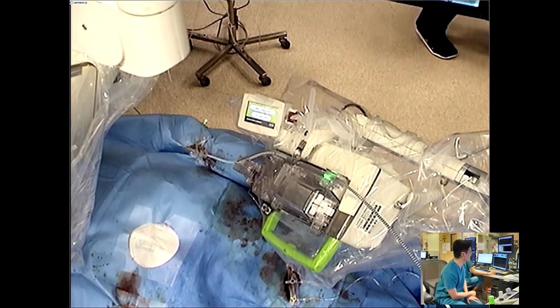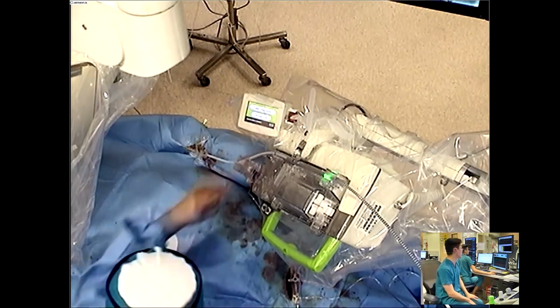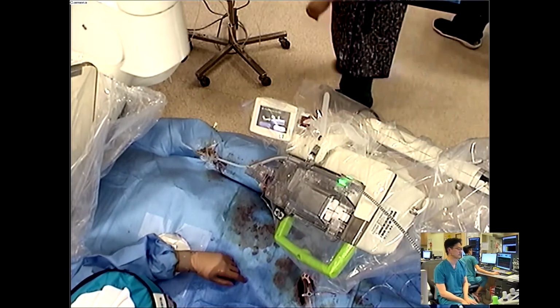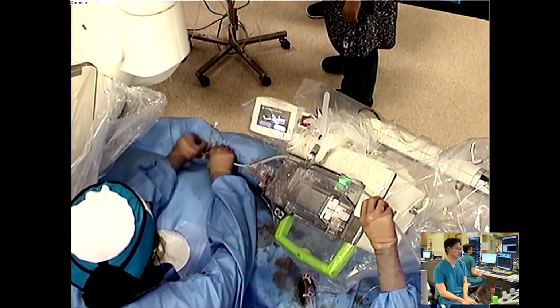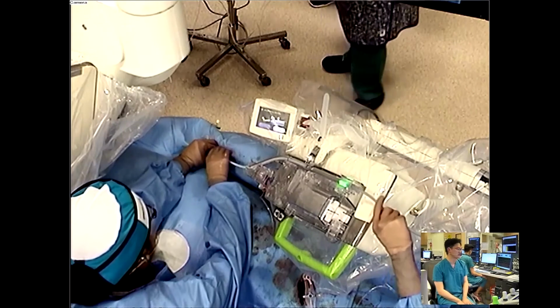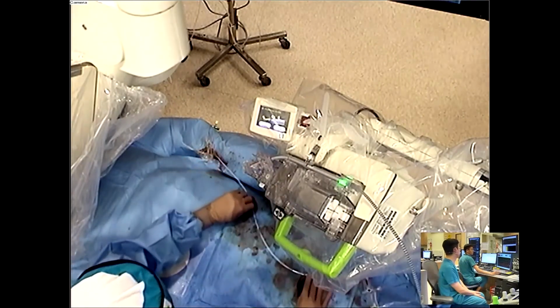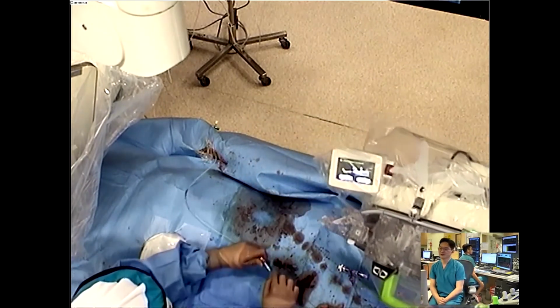So I'm going to ask, is Deborah ready? Ask her if she's ready. Ready? Okay, so you're going to see her taking the patient off. Can you start the timer? Yeah. So as you see, she is going to take the patient off the robot. Okay, so unlock, unlock, disconnect the patient from the robotic arm. This is in case the patient suddenly deteriorates during the procedure. If for whatever reason you're not happy, then you want to go back. See, that's it, stop. 22 seconds. That's all you need to take the patient off the robotic arm.